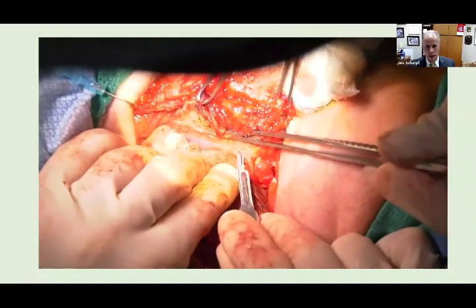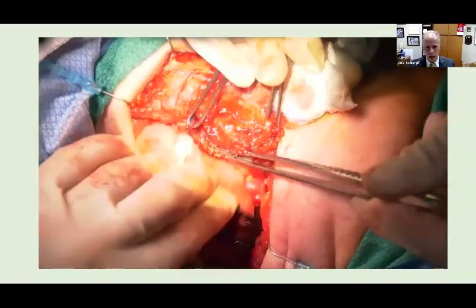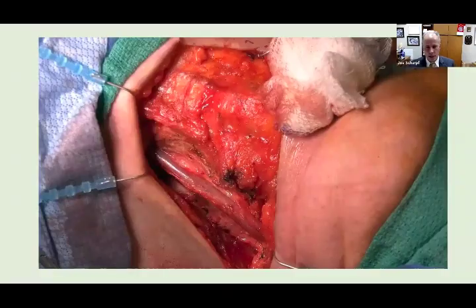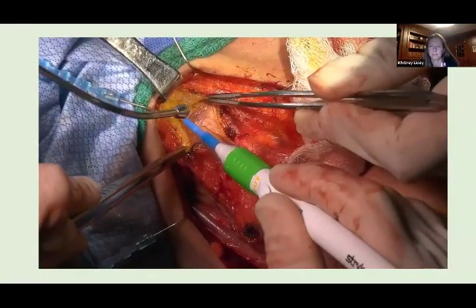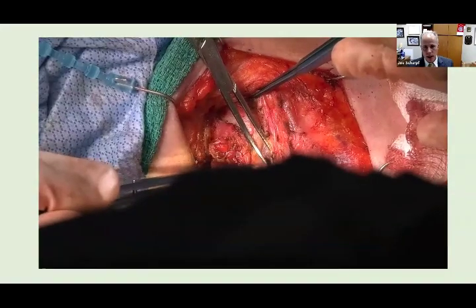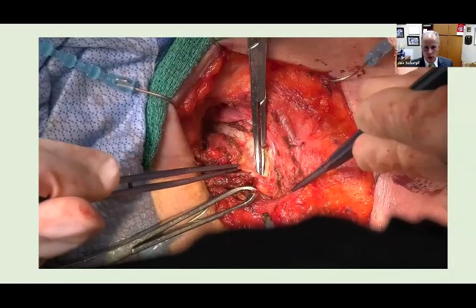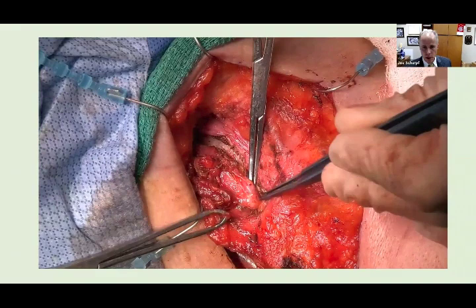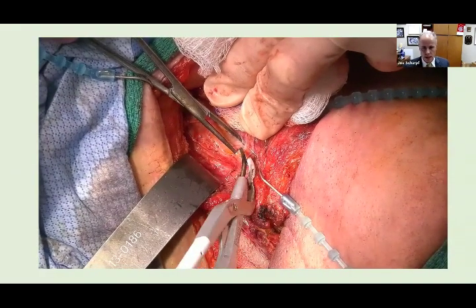Once I've gotten the neck dissection completed, I think we got about 30 nodes or so out of this. I'll go ahead and look at the vagus again, but I wasn't getting any signal. Again, the person didn't have signal beforehand. I have gotten used to just taking the strap muscles completely with some of these. Unfortunately, I can't open the cricothyroid space very easily with some of the scar there. So I'm looking for big landmarks like the cricothyroid muscle, and I'm taking the strap muscles with me in these particular cases.